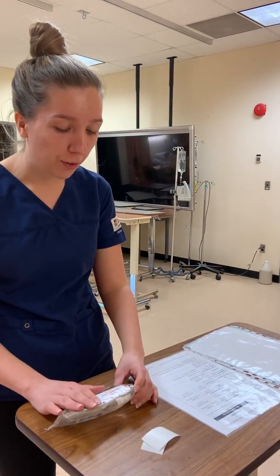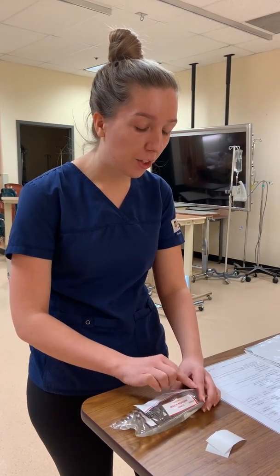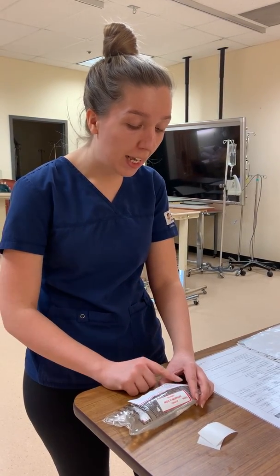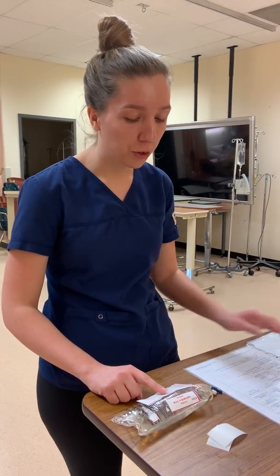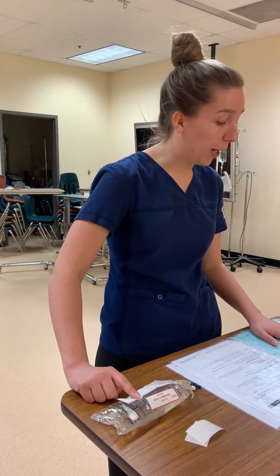I have the bag of 25,000 units, 100 units per ml is the concentration, and the volume is 250 mLs. Now looking at, again, my label, I did indicate that the dose is 25,000 units, volume 250 ml, same with diluent, and the concentration is 100 units per ml. And I also wrote the prescribed amount, which is 1350 units an hour, as indicated on my MAR. So I've completed my second check now.